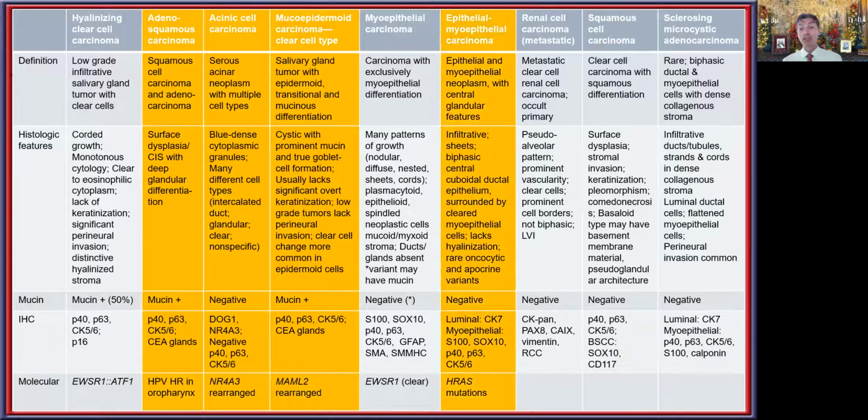One of the interesting things about this is there is some significant argument around whether this could actually be an example of a tumor that is in fact a squamous cell carcinoma variant. And of course, that is what is being considered by many authors at this particular time. You'll notice that the minor salivary gland is by far and away the most common location for this, with more than 80% of the tumors presenting in that anatomic site.